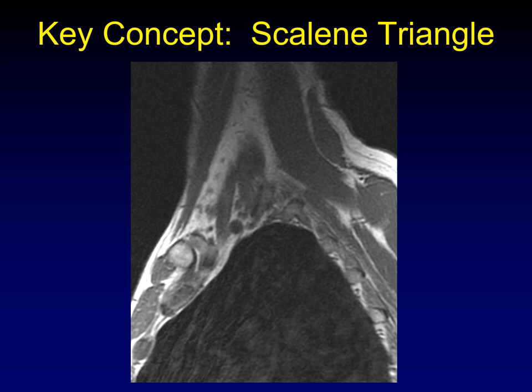The scalene triangle is perhaps the key concept of brachial plexus anatomy. The anterior scalene muscle, middle scalene muscle, and posterior scalene muscle are visible along their length in the sagittal plane — the middle and posterior scalene muscles are often indistinguishable and appear as one muscle mass. The anterior and middle scalene muscles along with the apex of the lung form the scalene triangle. Running through the scalene triangle are the trunks of the brachial plexus — upper, middle, and lower trunk.